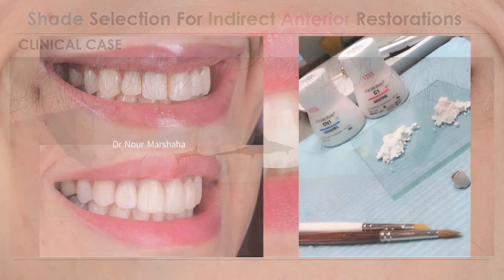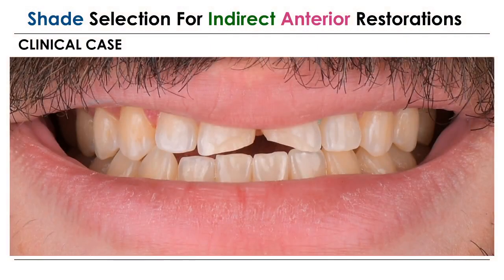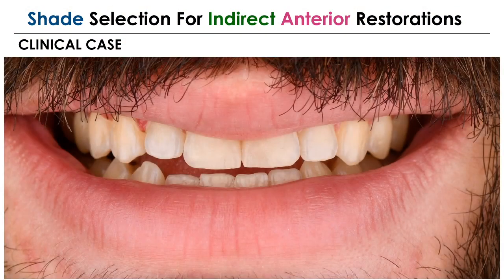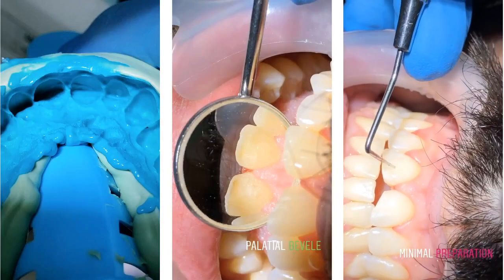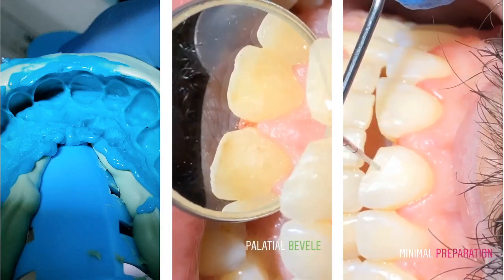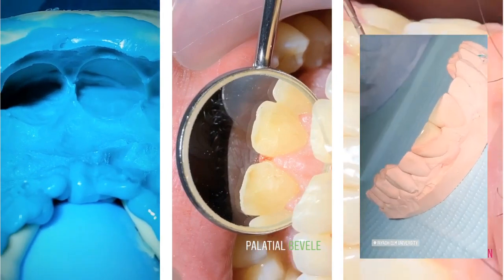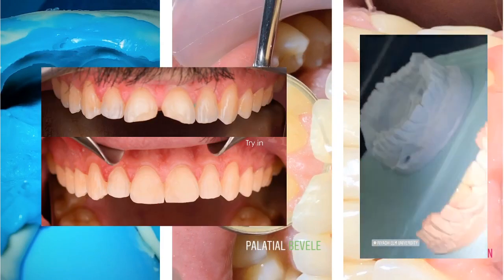Okay, and now it's very important to know the dental lab work and how they are going to stain the case. We can see here, for this case, I chose to put partial veneers, and this is the case after. Okay, how is it going to be like this? We have to understand how to do the minimal preparation, and we have to know how to document and send all the details to the dental lab. And it doesn't matter whether we try in the case 1 time or 5 times, it's okay, just to get this beautiful smile. This is in try-in.